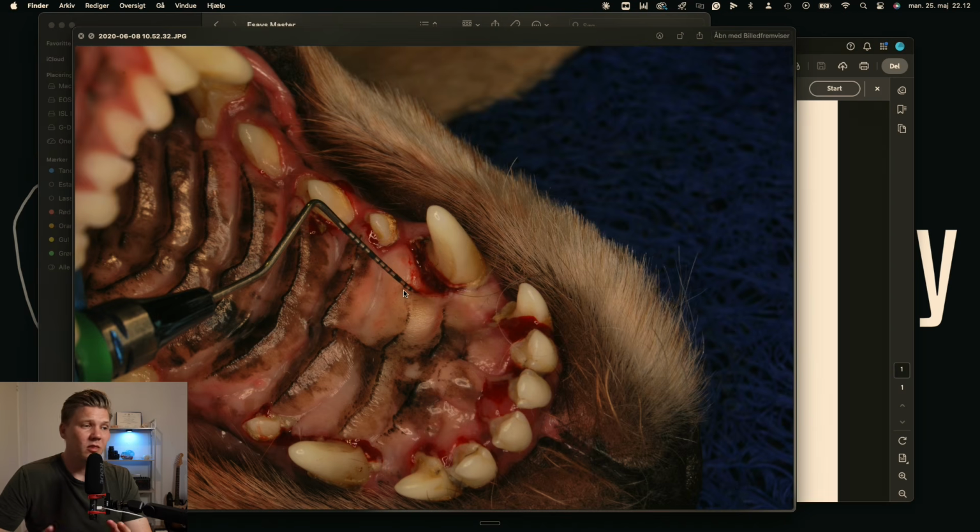Then you can place, depending on what it looks like, but in many cases you can place a bone graft like a Periomix, and then you can add some hyaluronic acid, you can add some PRF, and then a membrane on top. This could be a collagen membrane. It could be a new thing that's working in humans, a magnesium membrane that dissolves by itself. And so that's very interesting.